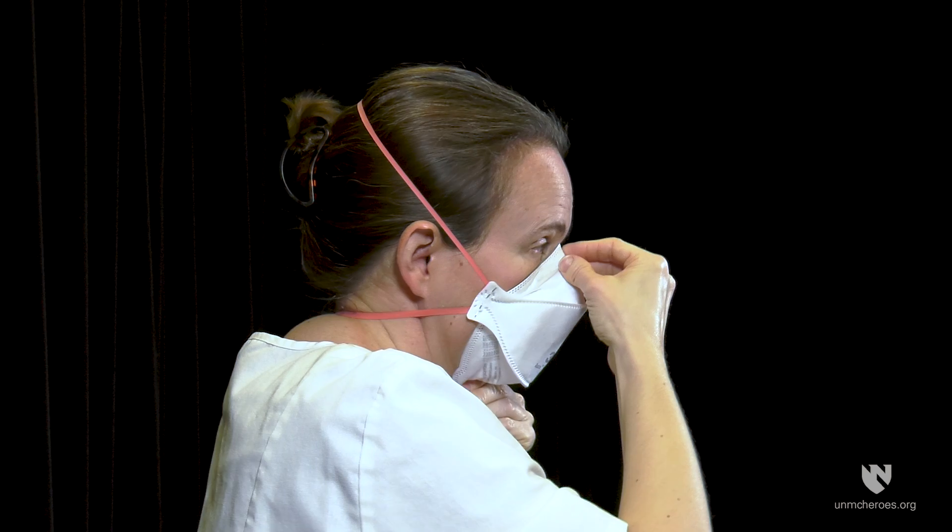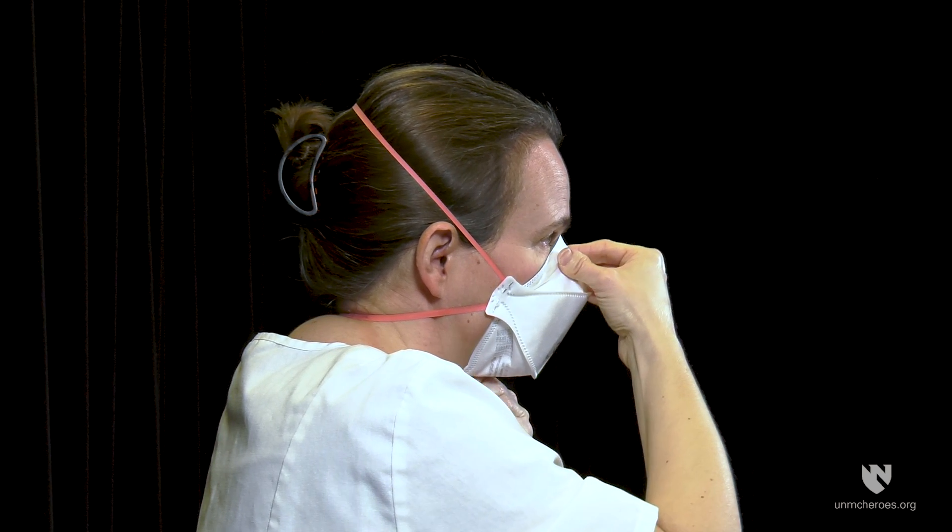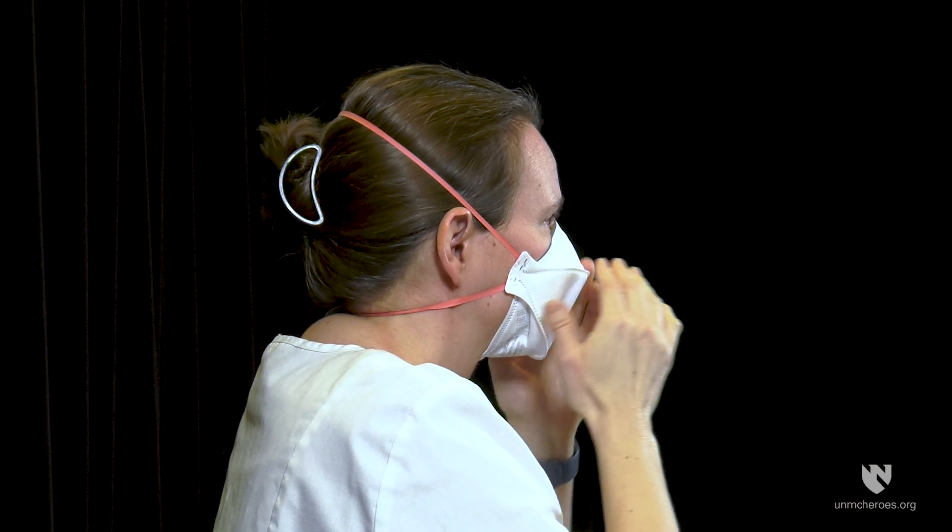Adjust for a comfortable fit. Pull the top panel towards the bridge of the nose and the bottom panel under your chin. Place fingertips from both hands at the top of the metal nose piece. Using two hands, mould the nose area to the shape of your nose by pushing inward while moving your fingertips down both sides of the nose piece.